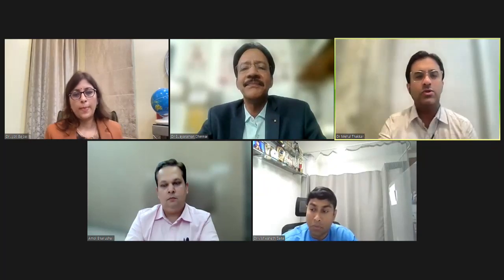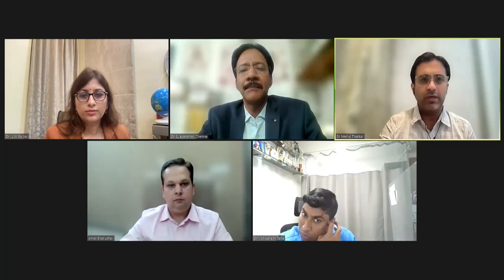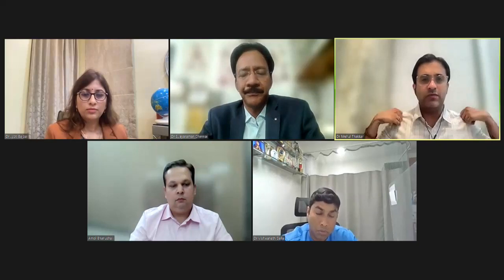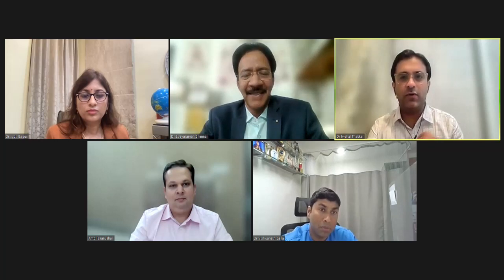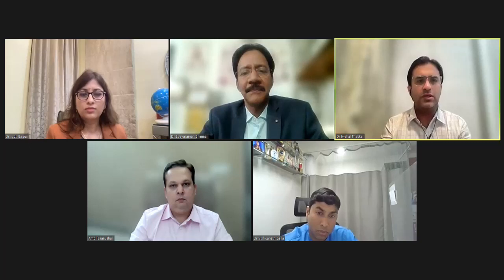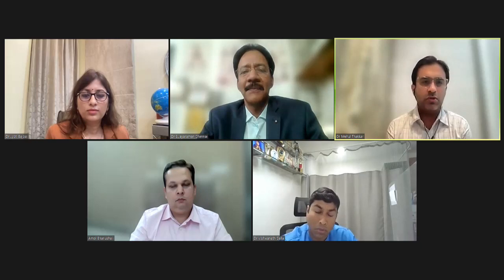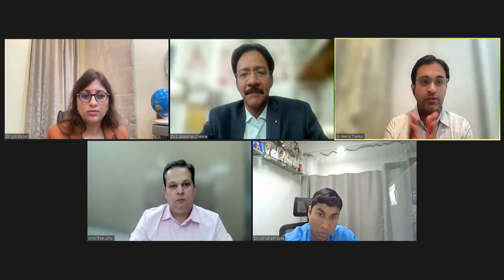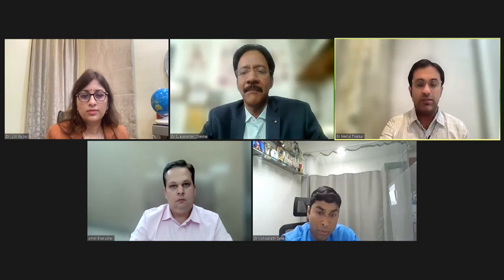Thank you, Dr. Jayaraman. So basically, if you can deal with stage 2 complications of bleeding, if you see a vascularized adhesion, you may not want to touch it, because if the bleeding causes your blood pressure to go low, you should not be touching that. That is the dictum I follow. This is not my area. So where you can intervene is stage 1. Unfortunately, most of the patients don't come to us, the pulmonologists, in stage 1. So many times we are left with no choice but to refer to a surgeon. But yes, if you are good with your thoracoscope, if you have a rigid thoracoscope, as you rightly said, we can go ahead and do some intervention and place the ICD, which is very important.